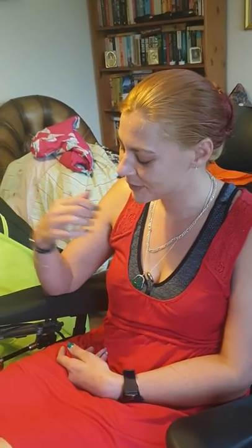So they're all connected up and ready to go, and they work through touch. Give us a run-through of what you can do with Sisyphus. So this is usually where you plug in the wheelchair. Most of them have a specific charger. In the good old days when I first had my wheelchair, you had a limited amount of charge — about 200 charges per battery — and you couldn't overcharge them. These days, Sisyphus is a trickle charge, just like my powered wheelchair Pegasus, which makes it a lot easier. You can just leave it plugged in.